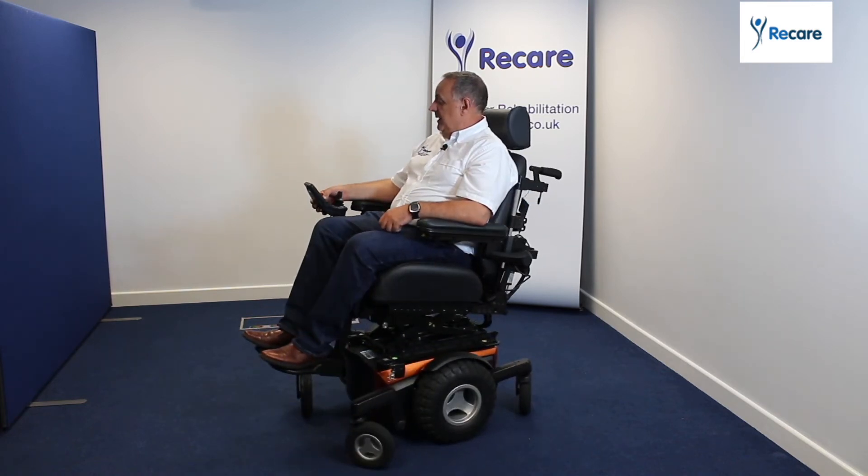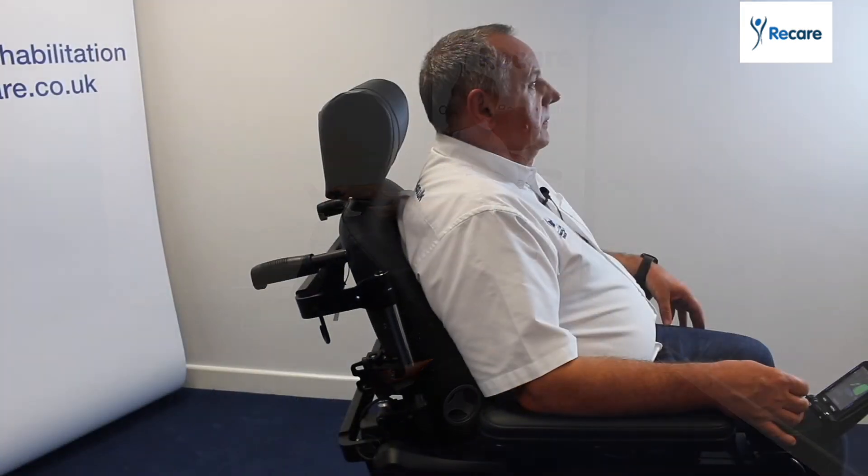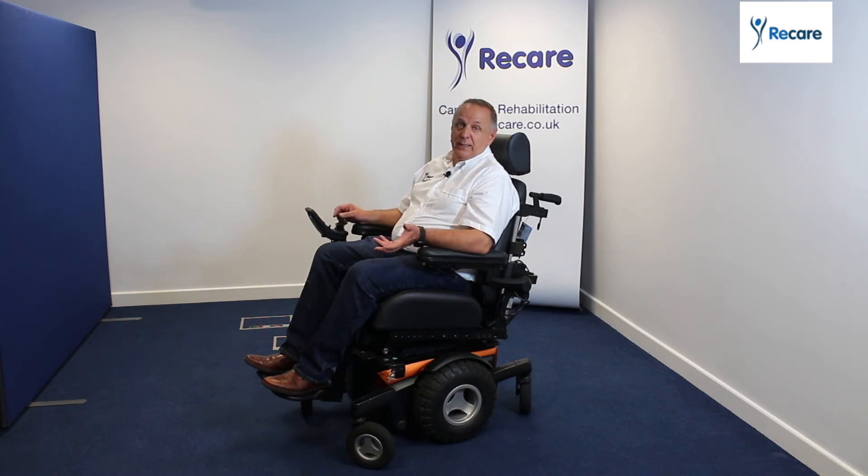Last but not least, we've got the reclining back function. The reclining back function basically allows you to readjust your position throughout the day, because not all of us can sit in one position. So if you've got a reclining back — electric — you can change your position during the day, especially if you're off-roading outdoors; you're going to want a bit more flexibility in your seating and be independent as well.